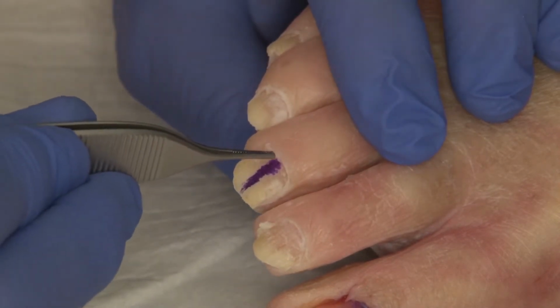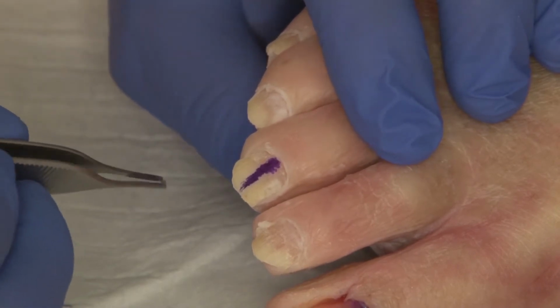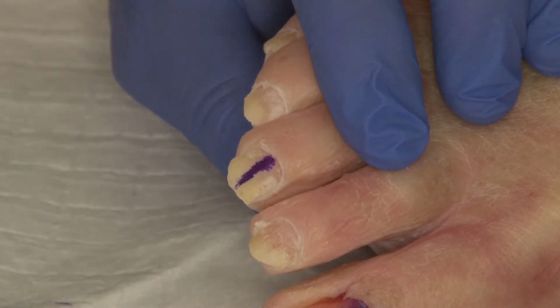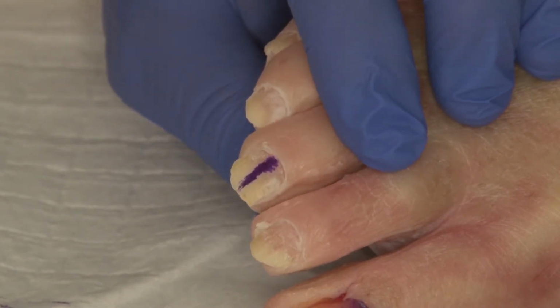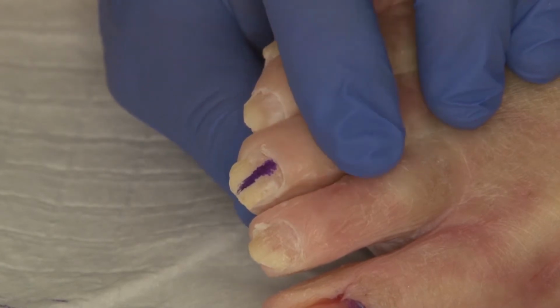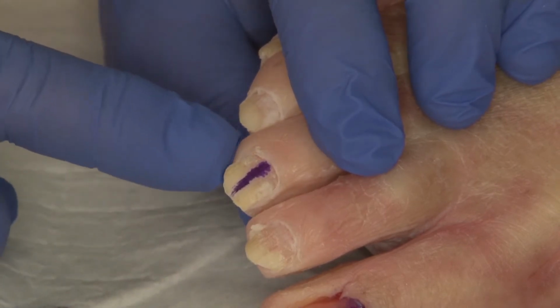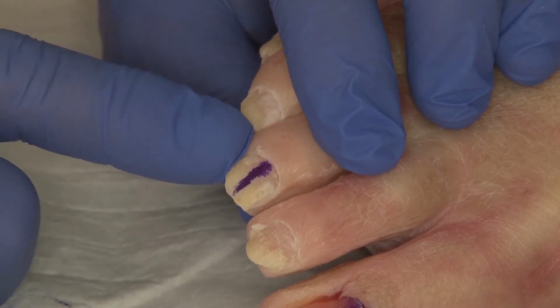As you can see, we have marked the nail to simulate a lesion of longitudinal melanonychia. The purpose of the punch biopsy is to get the diagnostic portion of the lesion, which is always in the nail matrix. The punch biopsy has to be done in the most proximal aspect of the streak. Wherever the streak ends has to be identified, and that is the point at which we will do the punch.